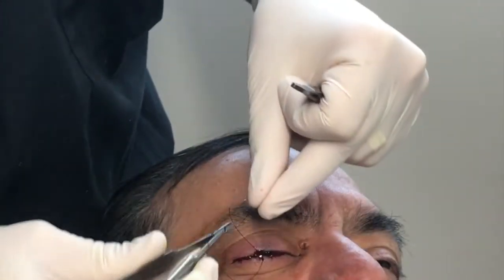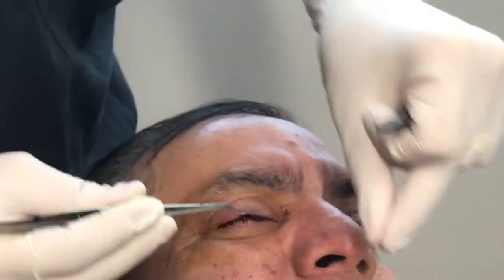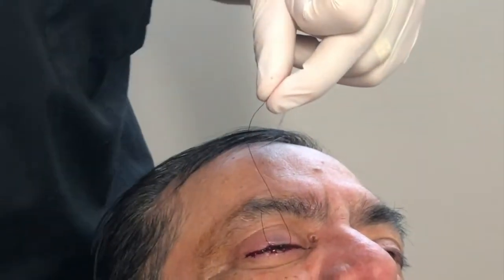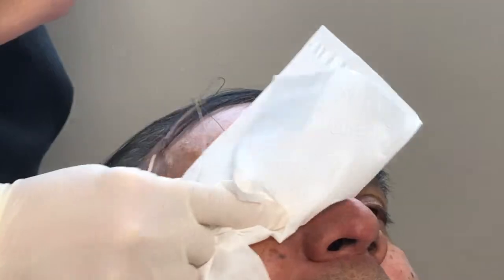I like this technique because you don't need to use bolsters. It's very helpful for patients that are having corneal ulcers or non-healing exposure keratitis due to decreased sensation of the ocular surface.